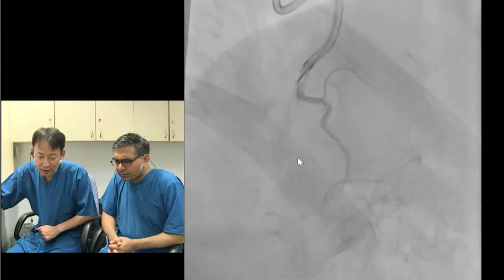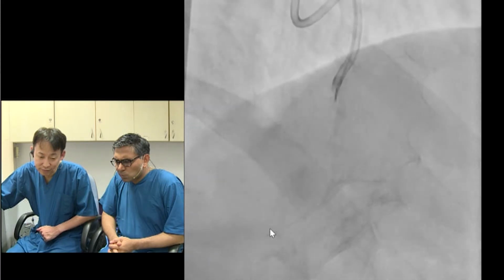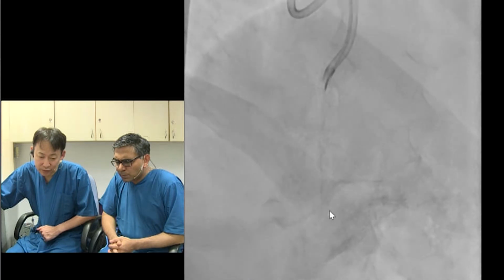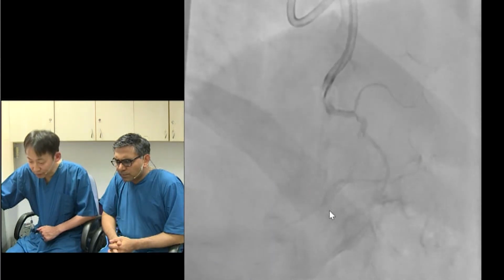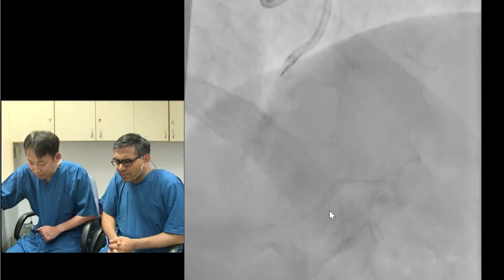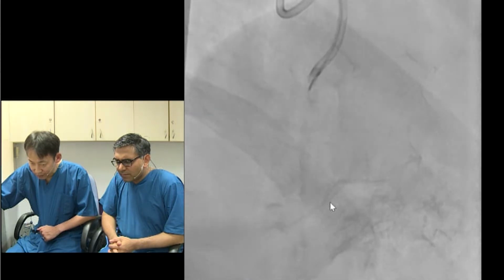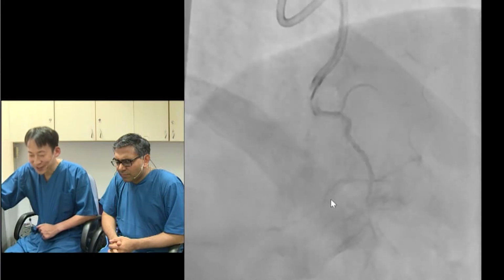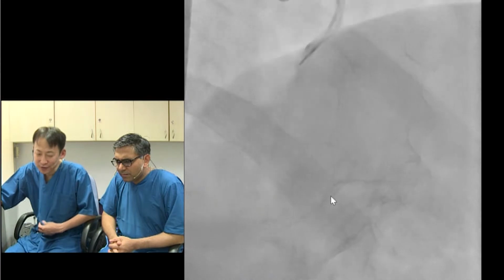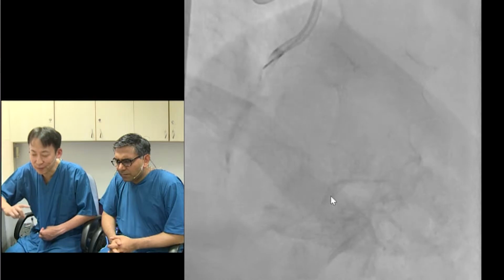So anyway, this case is a retrograde option. Nasu studied with the antegrade approach, of course. From our diagnostic catheterization findings, we can see some tiny channel from the first septal channel to the 4PD. Yes, sure. Actually, in 2008, in the angiogram, the collateral was not good, but there was some collateral connection through the septal to the PD branch.